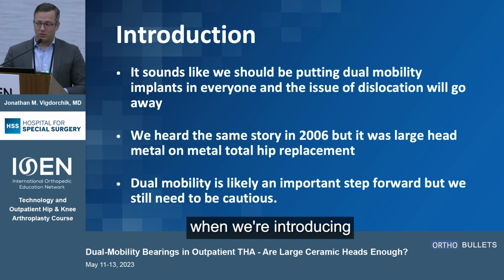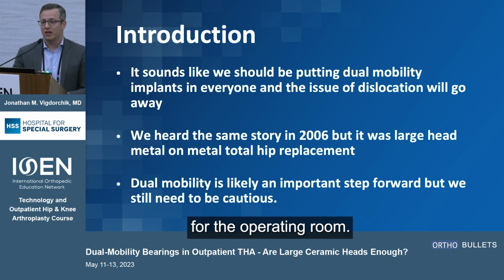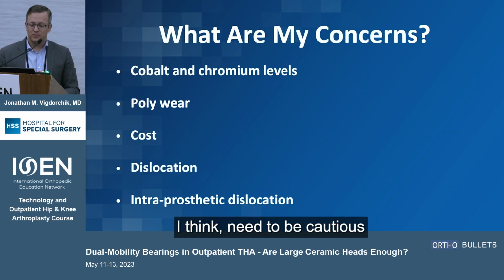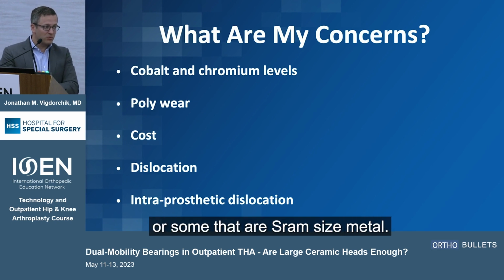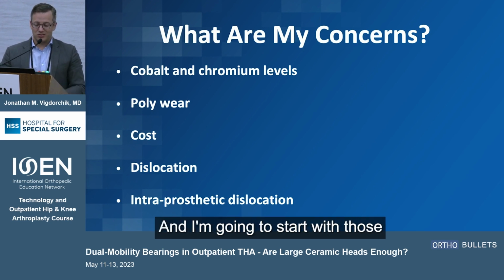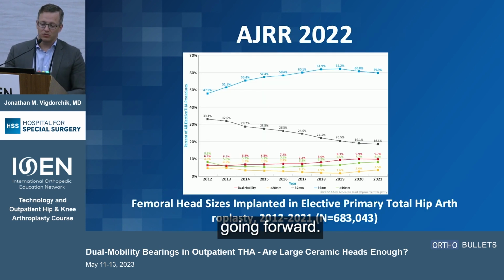So we have to be careful when we're introducing these new technologies, and this is technically a new technology for the operating room. It is an important step forward, but I think we still need to be cautious. Concerns: cobalt chromium levels. Now, not all of them are made with cobalt chromium. There's some that are ceramicized metal, so maybe that mitigates it. Polywear, cost, dislocation, intraprosthetic dislocation. These are my concerns, and I'm going to start with those and then tell you when we use it now and what I think we should do going forward.